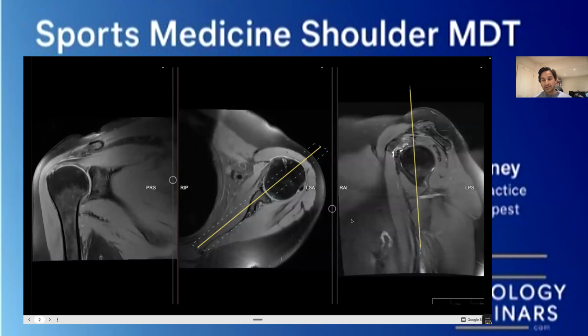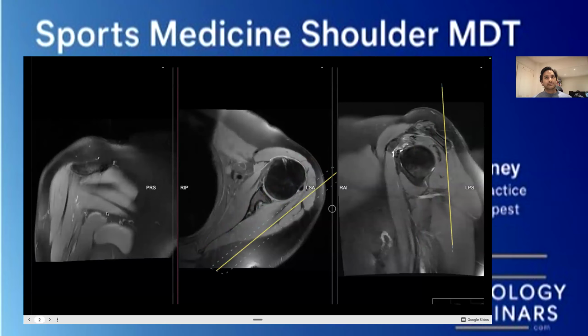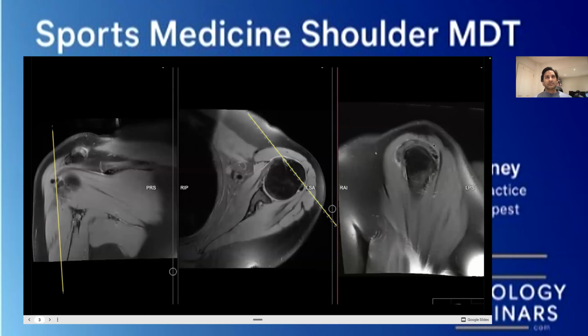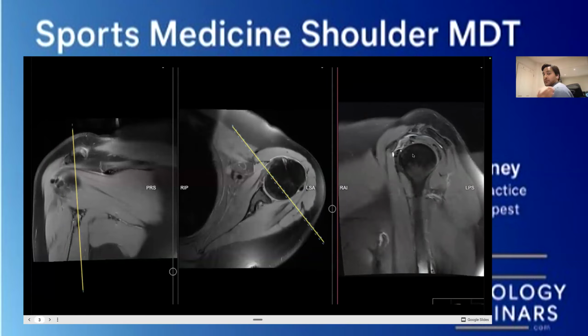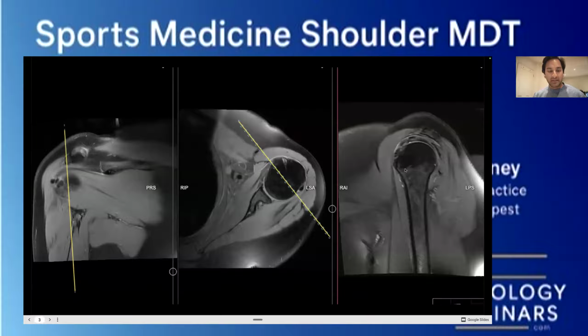There was one really big thing. And I'm going to scroll through and try and show you on this particular image over here. So now what we're looking at is the patient from the side. We're looking at them from the side and hoping they don't look back. And what you'll notice is that when you've got the humeral head sitting like this, it kind of, to me, looks like a face, right? I haven't drawn a great face, but it looks like a head, and they're looking straight at you.